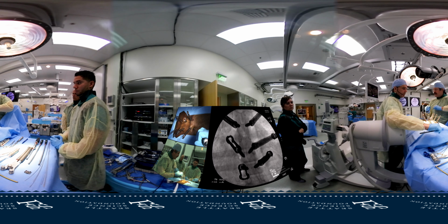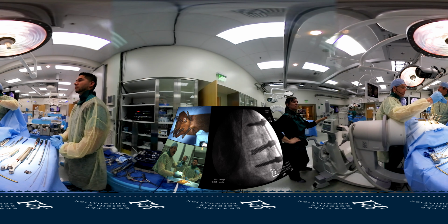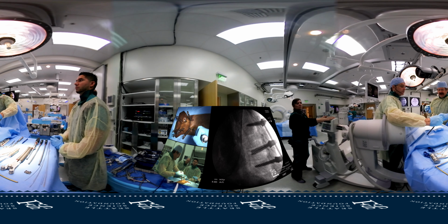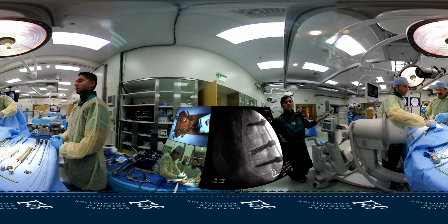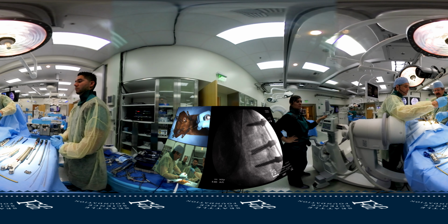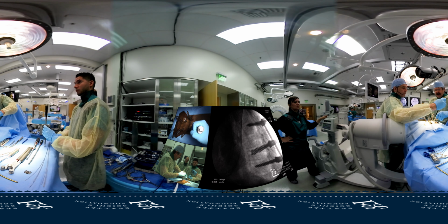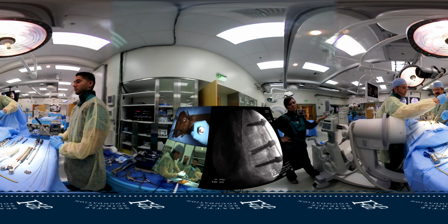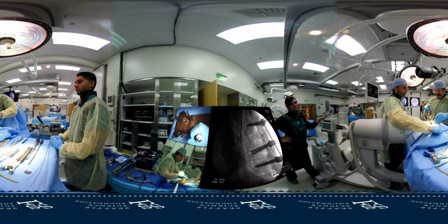Okay, so I'll take a picture here and I'll check, and you can see my rod's up to the screw. That means I'm either a little medial or lateral. The nice thing is I have a curve to my rod and I can match it. And like right now, because I have my left hand on the screw, I can feel myself hitting the screw. I can feel myself going through. I can feel that it stabilized the screw. So I'm pretty sure I'm in. Similarly, I can move it up and down, and I can see that moving, and I'm in.